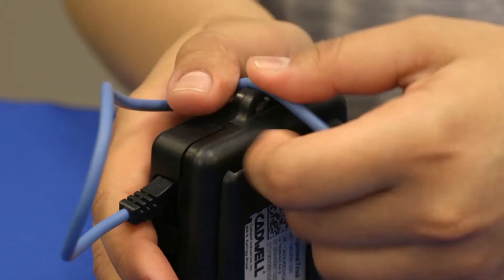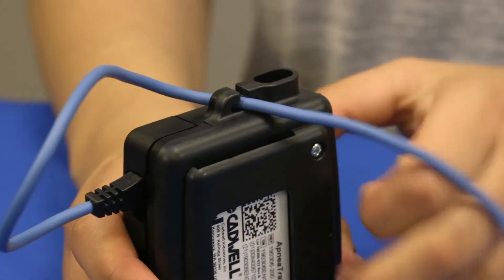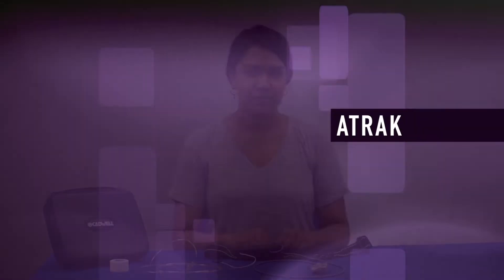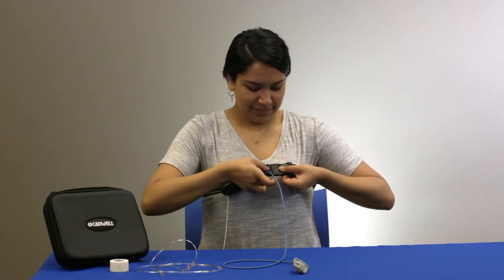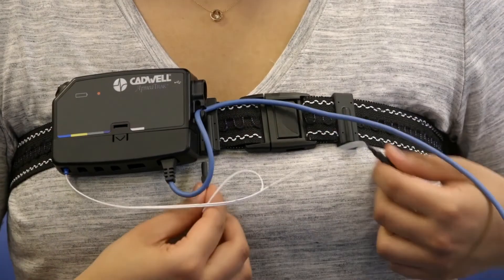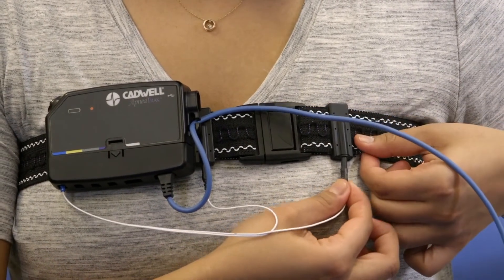Press the oximeter cable through the hook on the side of the apnea track. Place the chest belt around your chest and fasten the buckle. Connect the two black cables from the chest belt into the jacks on both sides of the chest belt buckle.